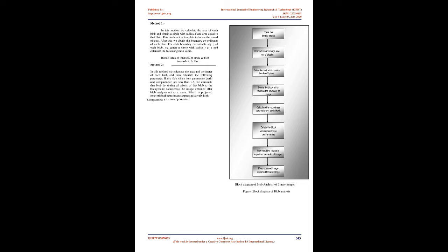Diagnosis procedure. Computer-aided diagnosis. To identify the early stage tumors is an important goal of physicians, because then it is easy for successful treatment for patient. Computer-aided diagnosis, CAD, involves the use of computers to bring suspicious areas on the medical image to radiologist's attention. It assists the radiologist for better diagnosis. CAD system scans the digital image and marks the suspicious-looking areas in the image. Radiologists focus on those areas and decide if a biopsy or further evaluation is needed.